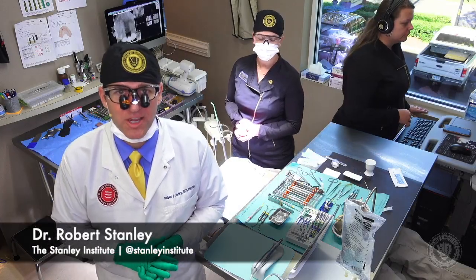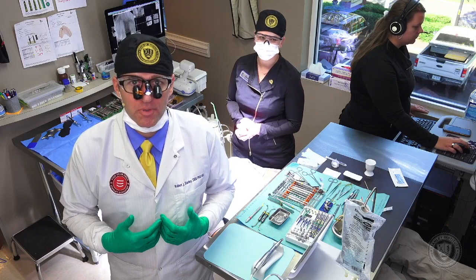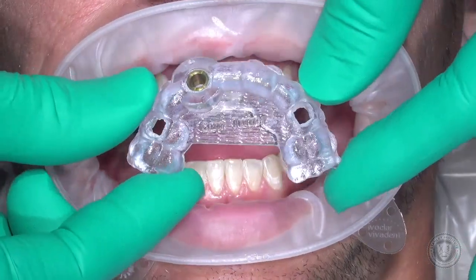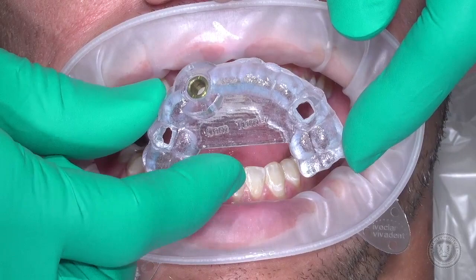Welcome, we're glad to have you guys here today. I'm Dr. Robert Stanley and we are going to be performing a guided surgery with a veneer graft. This is our surgical guide — it's color-coded and was created for us by Vulcan Dental.